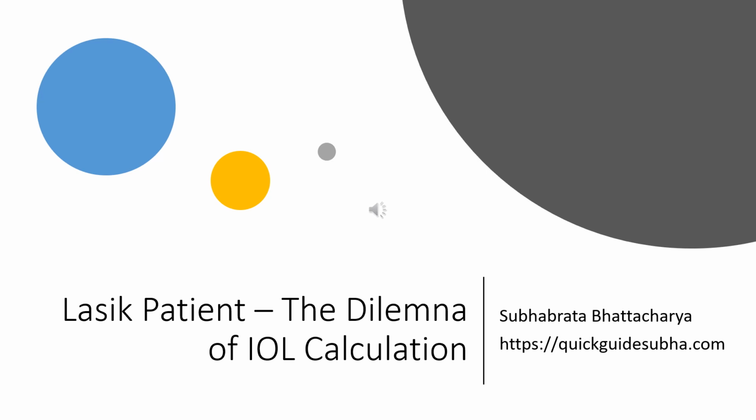Good morning, friends. The purpose of this presentation is to talk about how we can have a great outcome after cataract surgery for Lasik patients, for myopic Lasik patients, and there has been a lot of debate on which IOL calculation formulas we can use to get a great outcome for Lasik patients. But to me, the question is not just starts and ends with IOL calculation formulas.